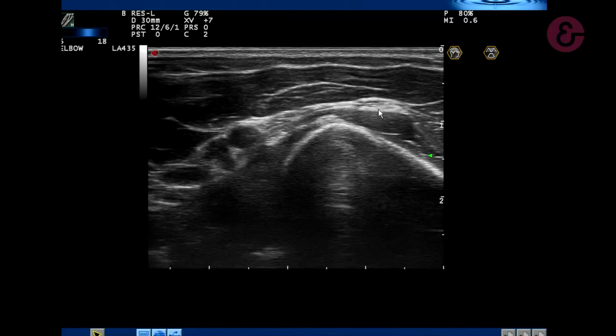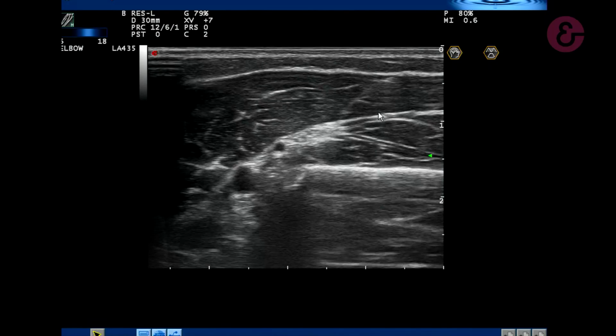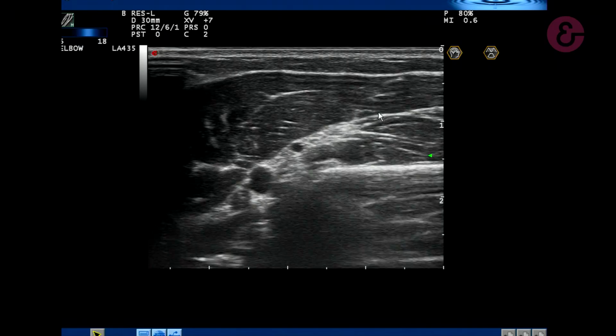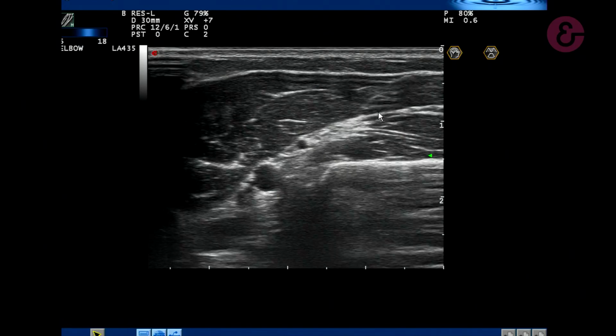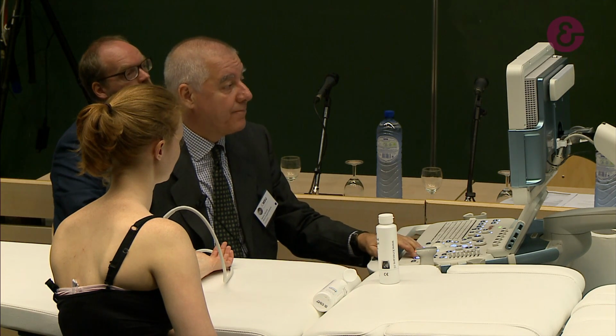So there are also other nerves you can locate depending on the clinical situation. And with time, we started to recognize every single small subcutaneous nerve, which can be injured in a lot of conditions, for example during venipuncture. So you can do that.